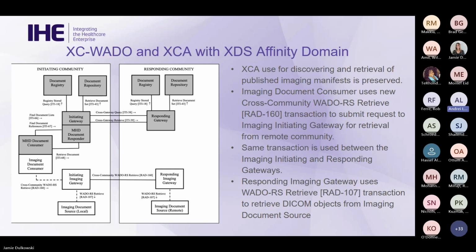So it's in the definition of the profile, the XCA profile semantics are being used for discovering and retrieval of published imaging manifests, and that is preserved in XC-WADO alongside with the same way as it is with XCAI.